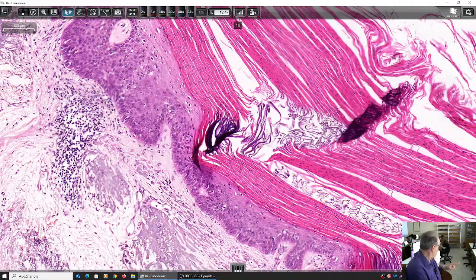The basal layers should be close to the basement membrane. If we see cells similar to the basal layers extending upwards, that means that the primitive compartment, the stem cells of the skin, start to predominate among the other cells. And this might be a feature that some sort of malignant potential increases in these cells.